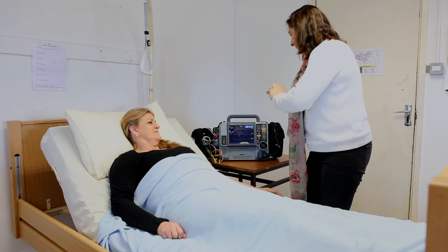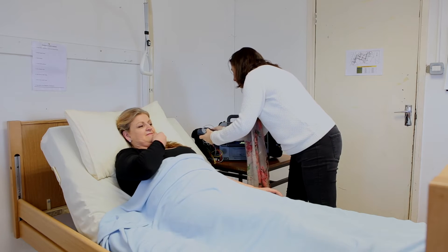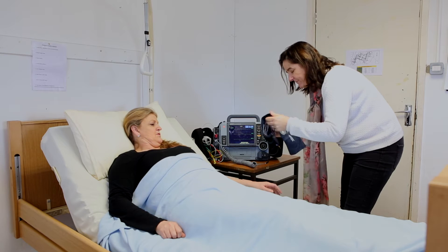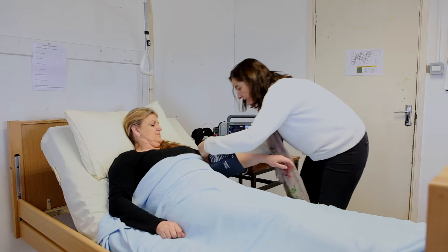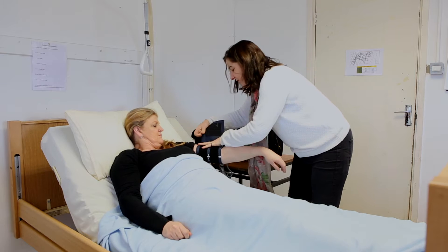I'm just going to sanitize my hands first. Have you had this done before? Yeah, probably have. Long time ago though. Just going to put the cuff on your arm here, Jean. Is that all right? Do you have any canes or anything like that? No.